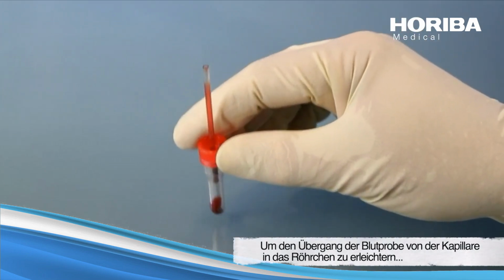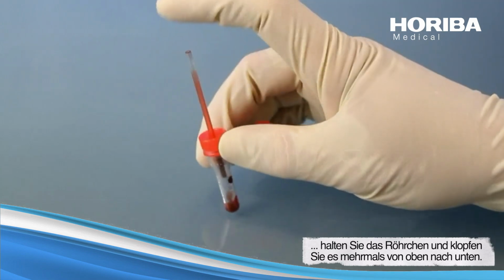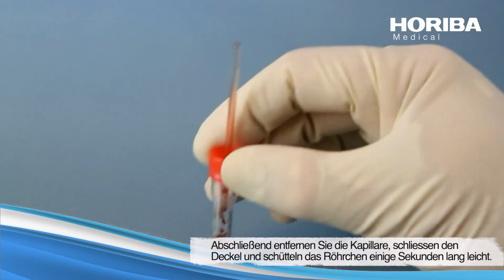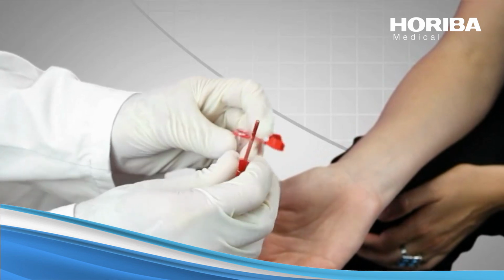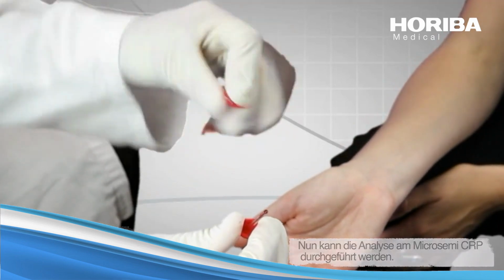To facilitate the passage of the blood sample into the tube, hold the tube with the capillary inserted and give it a few taps from top to bottom. Finally, remove the capillary and gently shake the tube for a few seconds. It is now possible to perform the analysis on the Microsemi CRP.